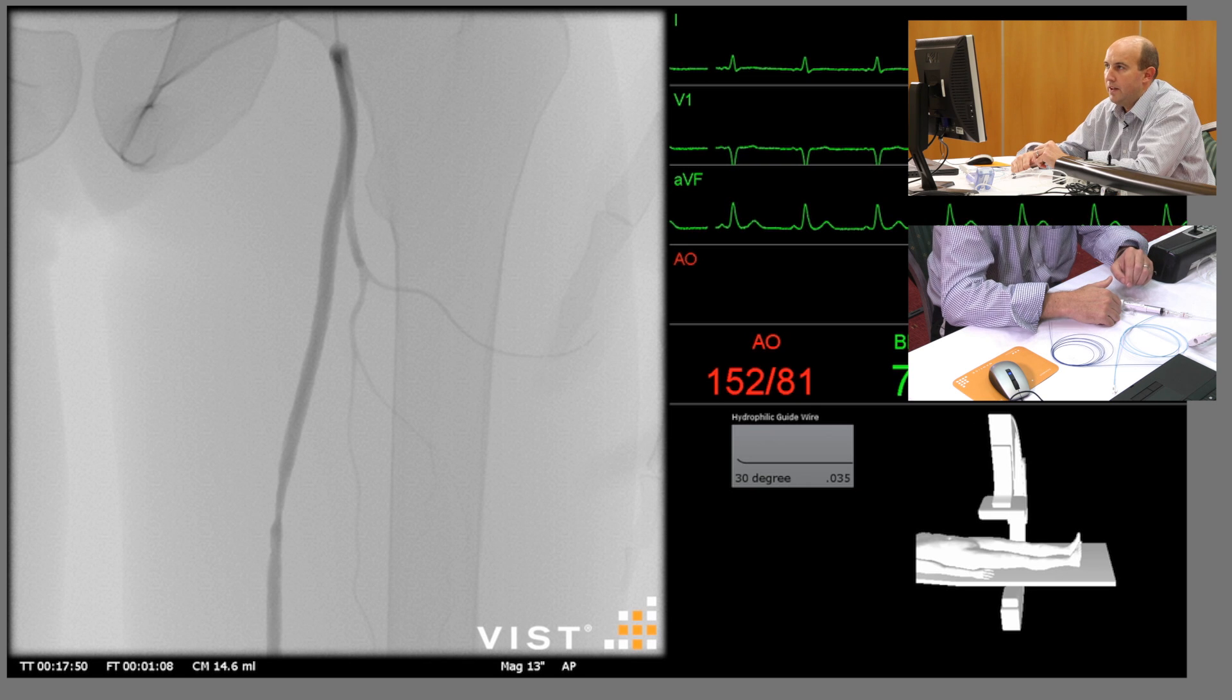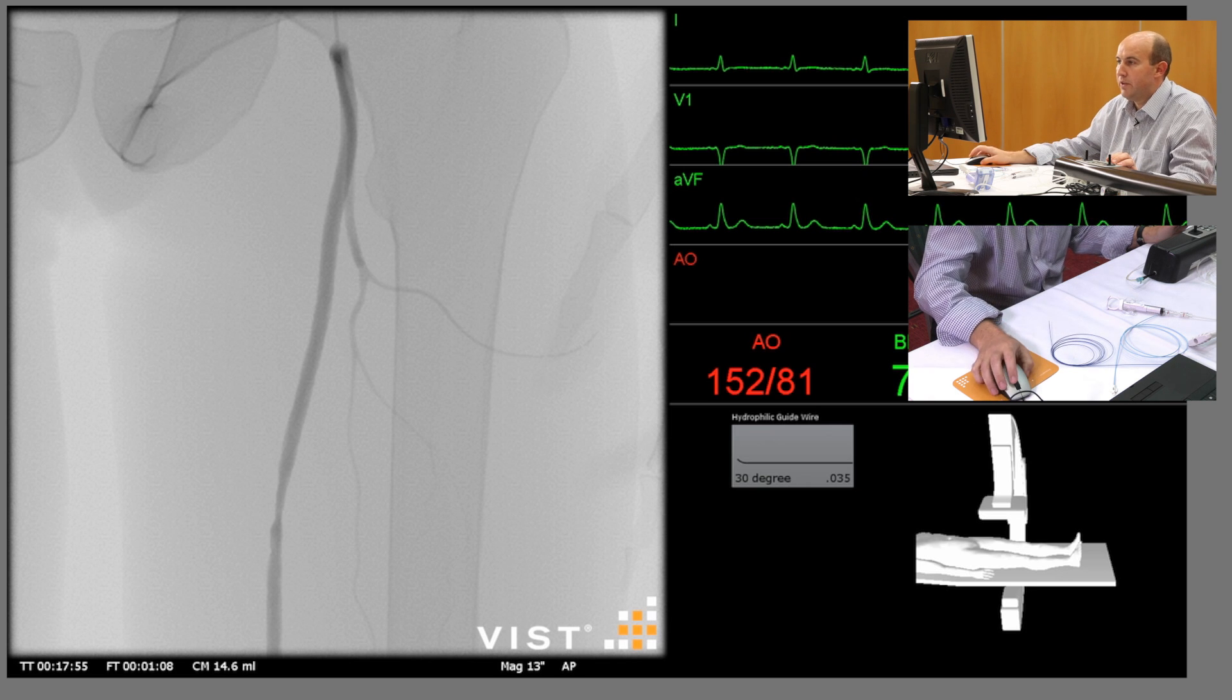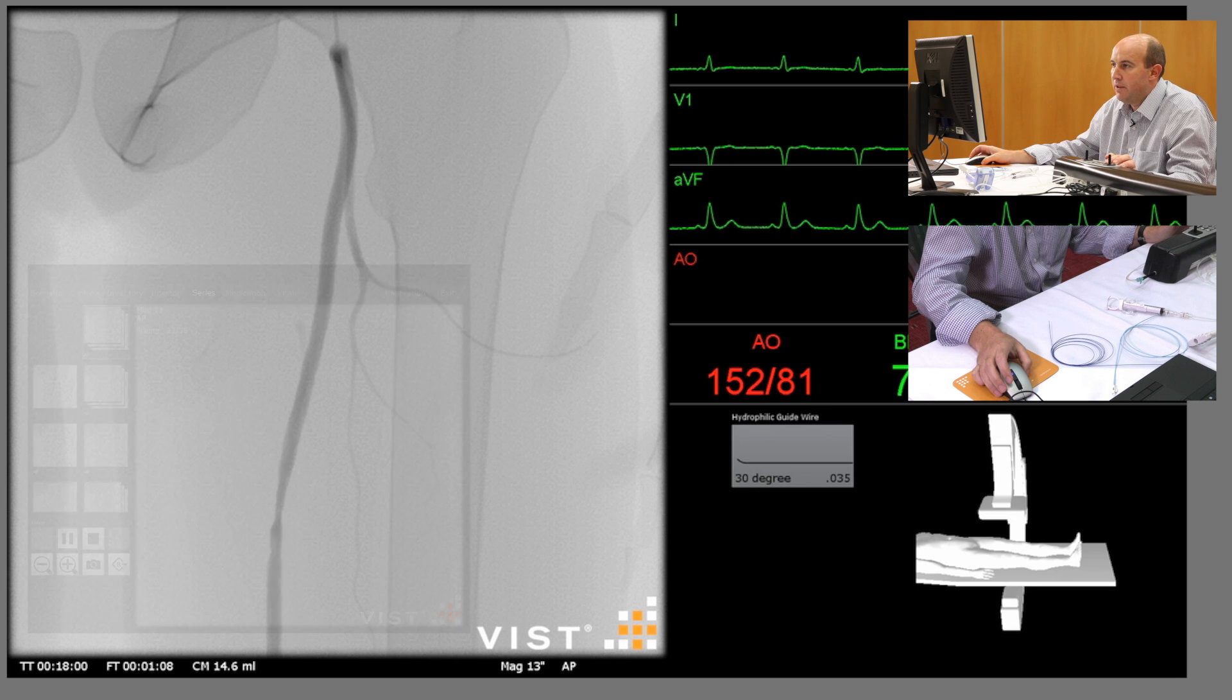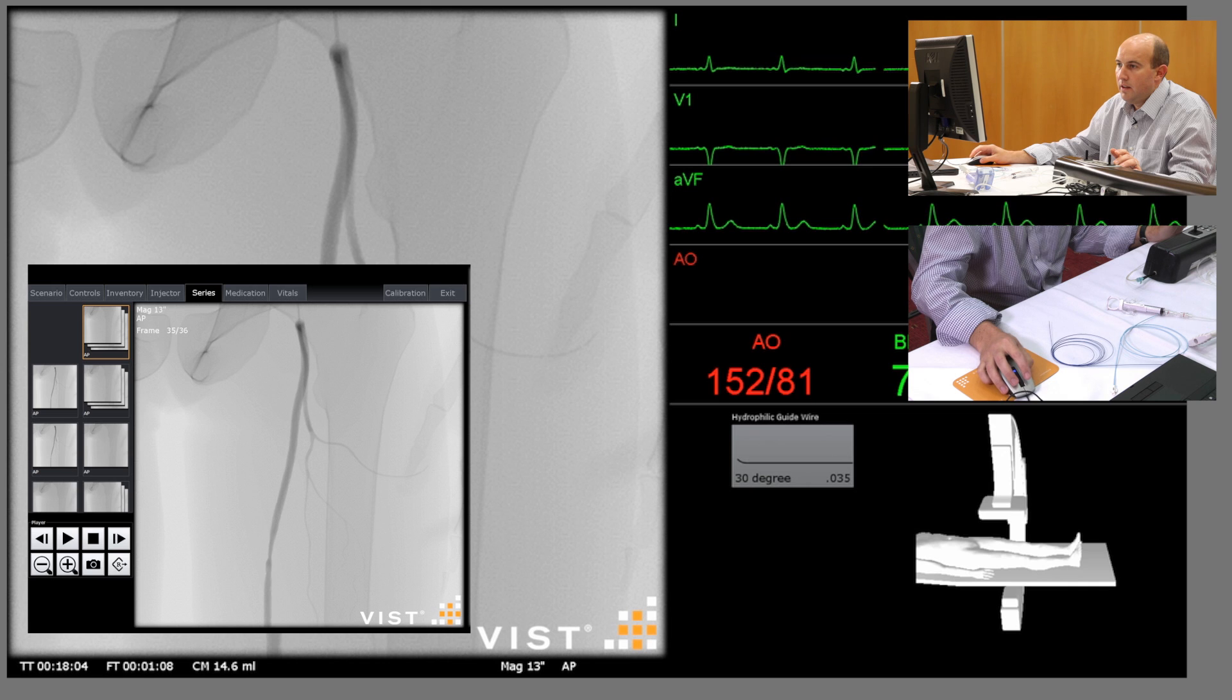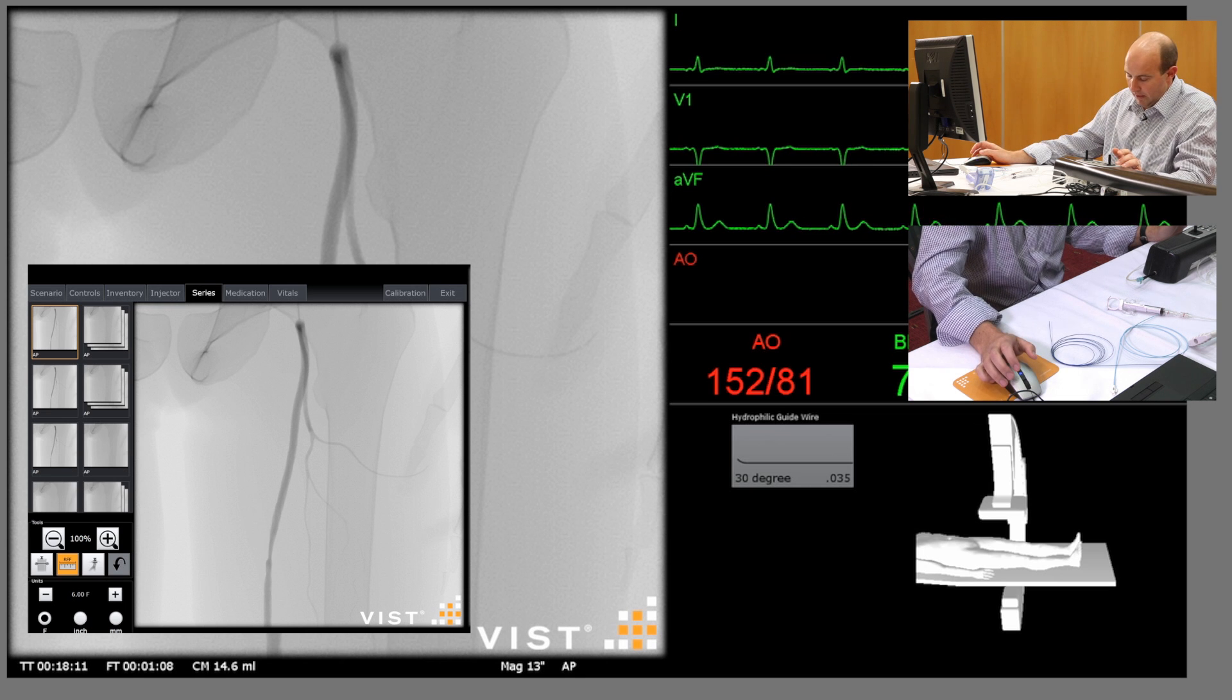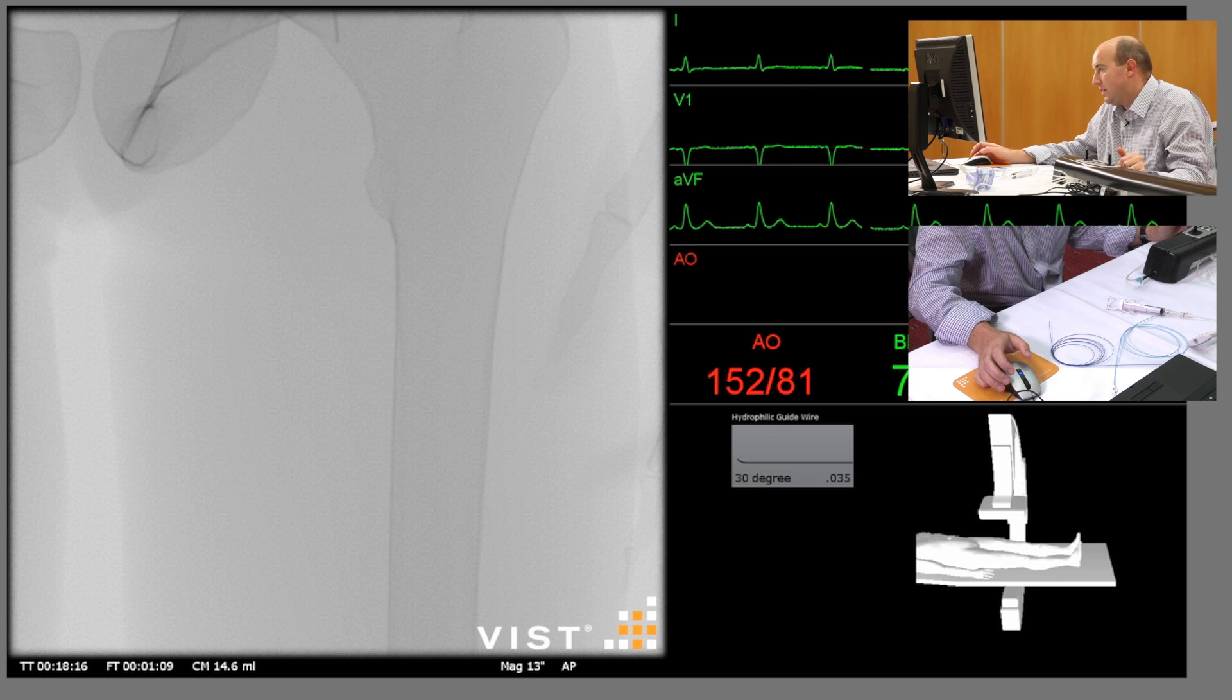Then what we'll do is use the function of a mask in order to assist the angioplasty. So first we will freeze an appropriate image which looks about that, select that as an image, and then take that across. If I know live image, there should be nothing on the right-hand screen, which there isn't.